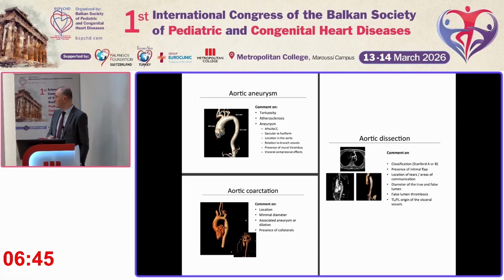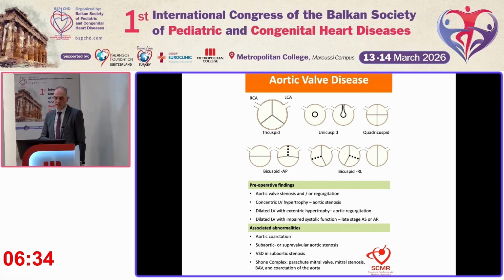As I said, in the acute setting, in the case of suspicion of aortic dissection, MRI would not be my first choice. There is a role for CT there, given its rapid nature. So the message is that MRI offers a comprehensive assessment of nearly all components of the cardiovascular system. And obviously, it has a central, a pivotal role in the assessment of congenital aortic valve disease as well. It replies to all the questions that we raised earlier during our first approach to the patient, to the new diagnosis of valve disease.